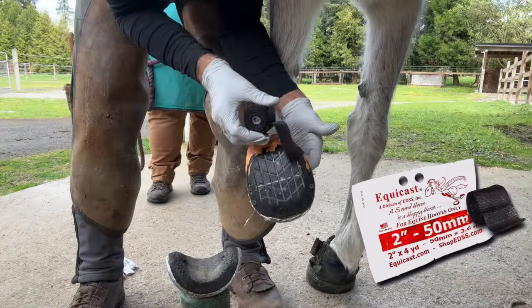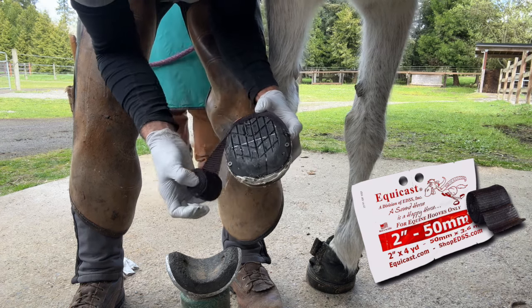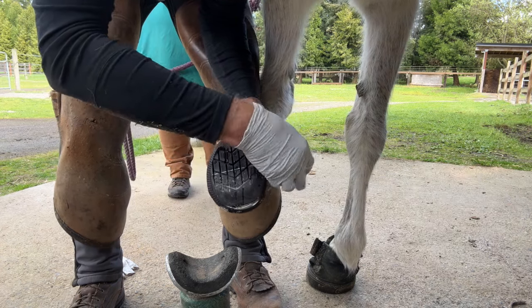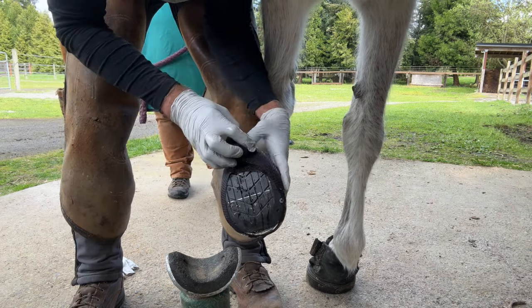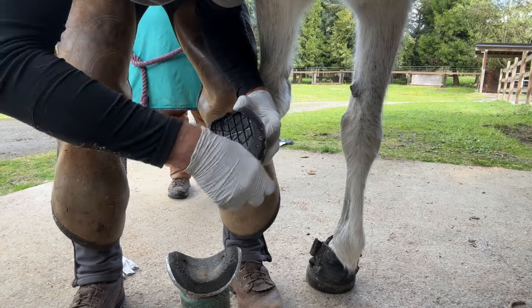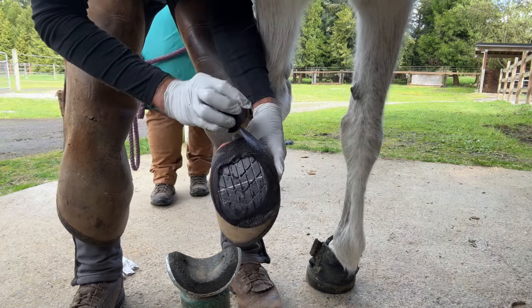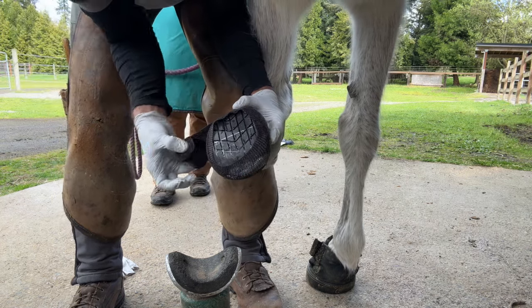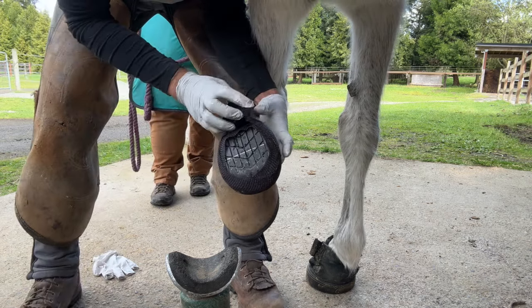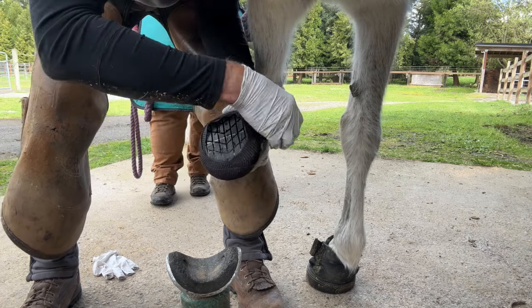So I like having my thumb here, catch it with my thumb finger. It wants to fall off the heel at first. So you have to do kind of these gentle wraps, because if you pull too tight, it will come off. Yes. And I kind of overlap my shoe and my hoof at the beginning.